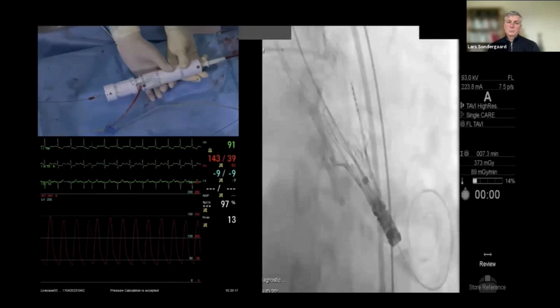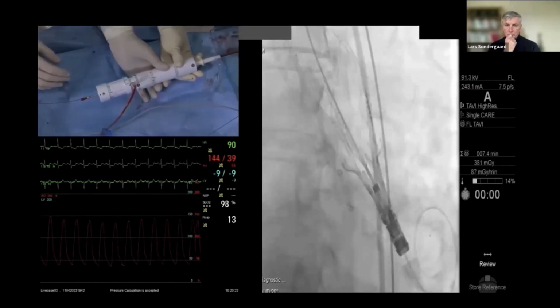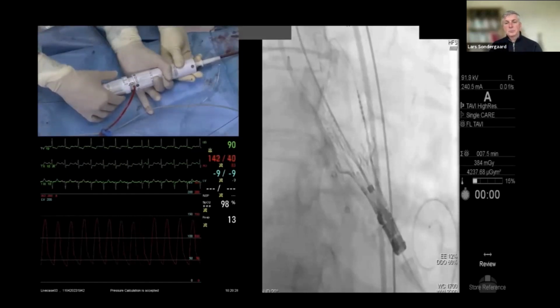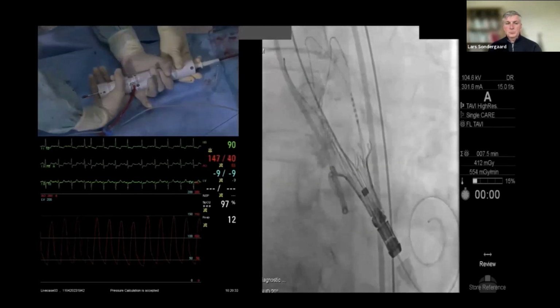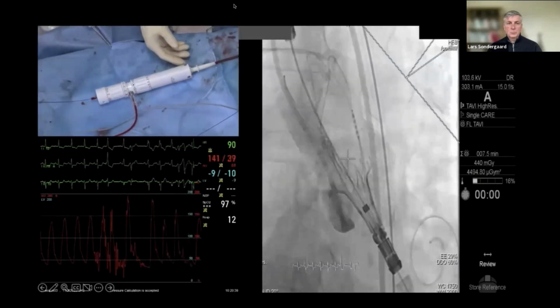So then we'll see. I would definitely give a little bit of push. So I'm already applying a little bit of push forward on our wire. The wire is making that bend. Yeah. I'm pushing really, and it sits nicely on those leaflets. So I do injection. We have you without pacing. It's just injection. Yeah. I'm happy. All right. You want to go? Yeah. That's good.